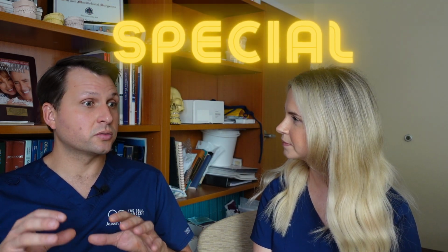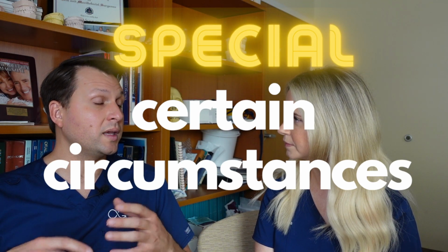There are certain special circumstances where we can extract the tooth and put the implant right in at the same time. And that saves you about 4 months. Wow. Sometimes even in those certain circumstances, we can put a tooth on it within a couple days. We just need to work with your dentist and make sure that all the scenarios are perfect, that everything is right for us to be able to do that.